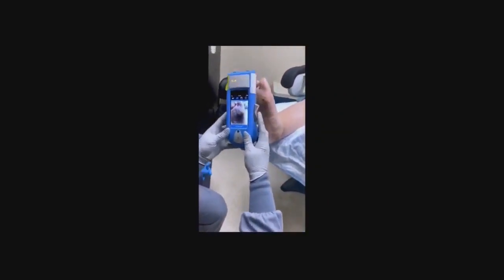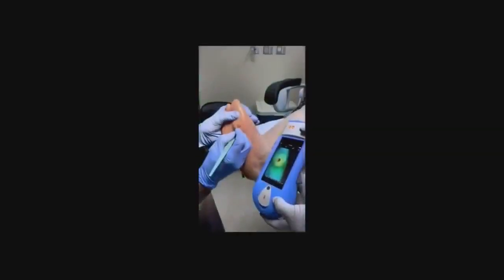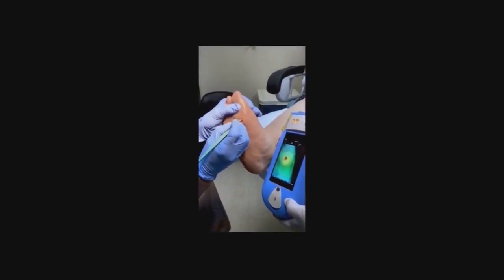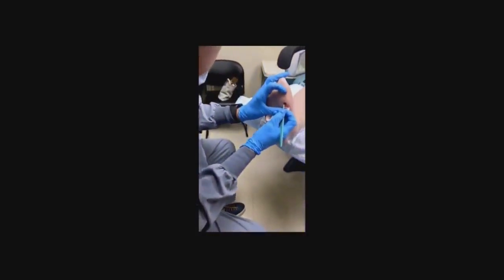Here we are scanning a wound. At the same time, what you'll see is I'm debriding that wound. Many times we will actually do the image at the time we're debriding. Here you see the fluorescence around that wound. And now with the curette, I'm debriding and trying to remove that fluorescence, that tissue that obviously has bacterial burden in that tissue. And then at the completion of that, we would continue to fluoresce to make sure that that bacterial burden has been removed.